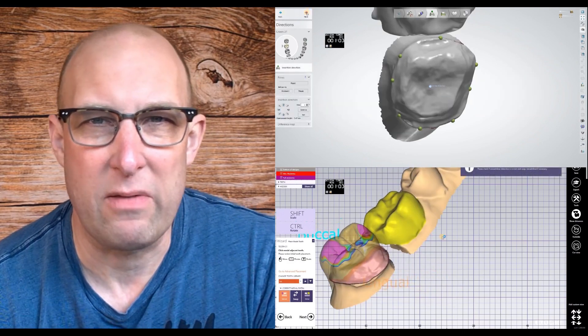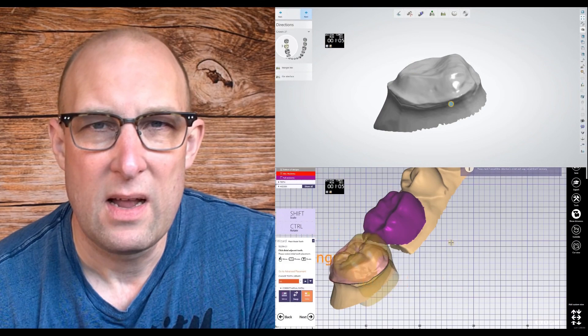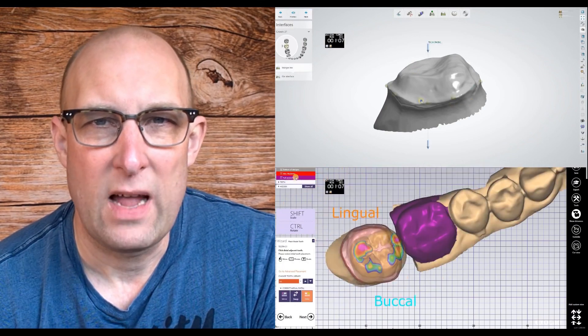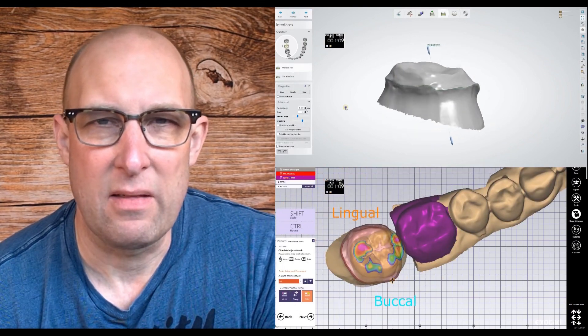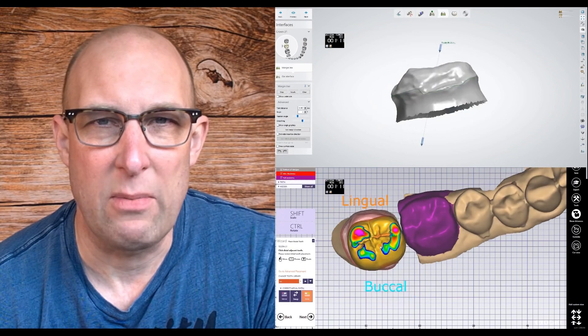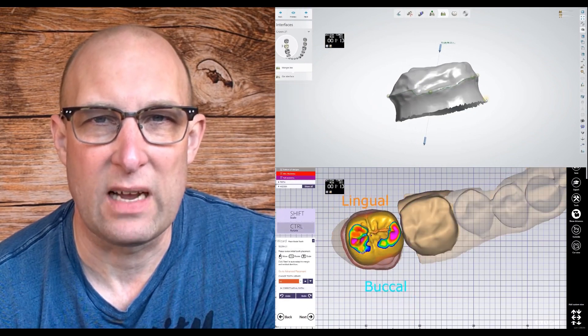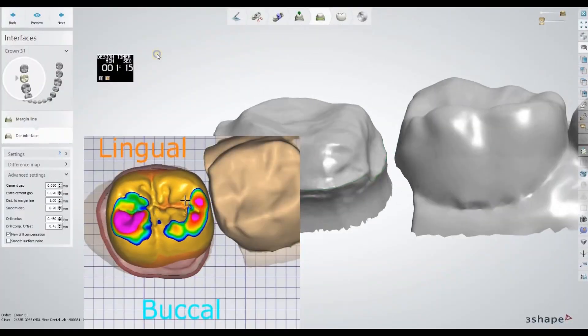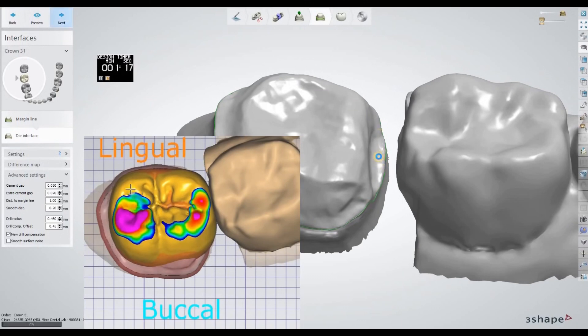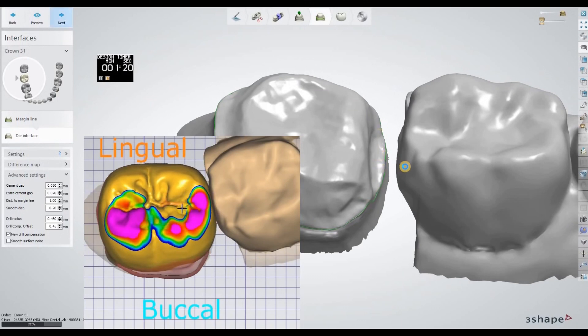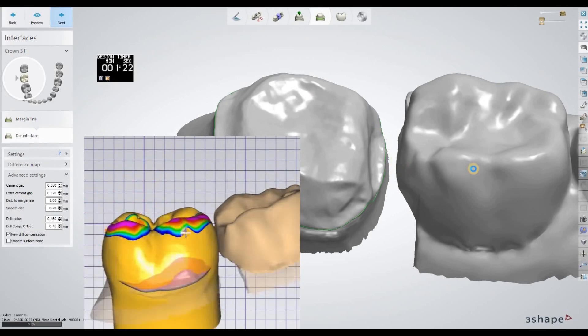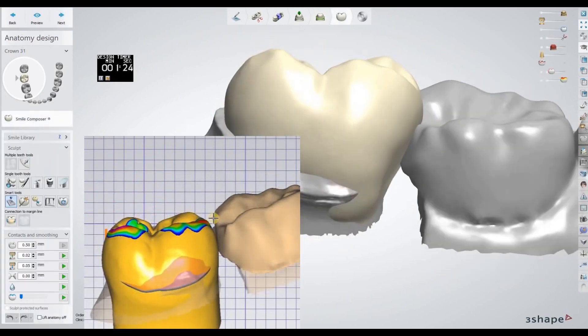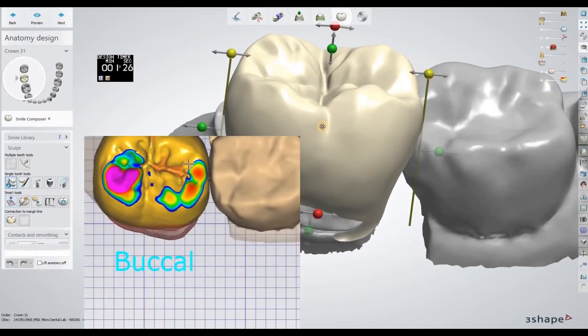Here in exocad, if you have to find the adjacent tools, you would be able to copy it now and exocad would let you copy the crown automatically. I'm rescaling it now in exocad. I'm still in the margin area. Now in three shape, I have my crown there too.